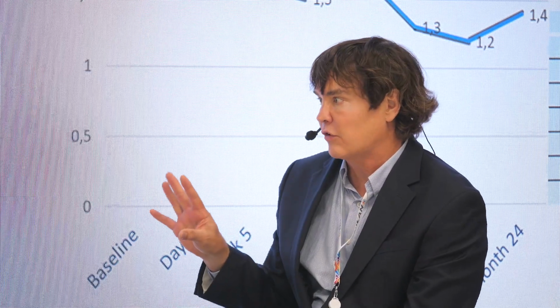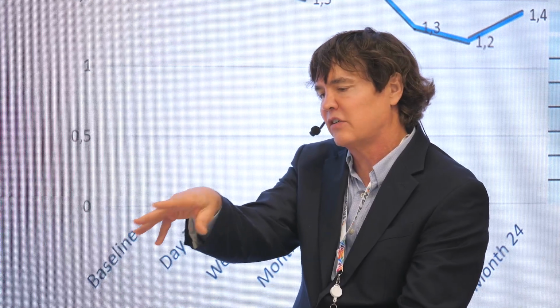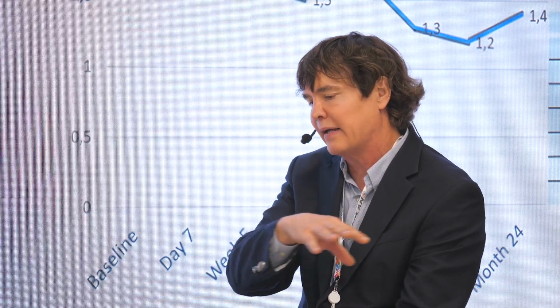And you're usually doing this after phaco's done, you put the IOL in? Or when do you do it? It depends. There are two attitudes. One, you want to have the IOL in, so that the cataract part's done if you're doing the combined procedure. On the other hand, if you don't put the IOL in, you can laser a lot of ciliary process. You can basically push the bag back. You can see the ciliary processes right through the capsular bag, and you get an excellent treatment if you're comfortable doing that.